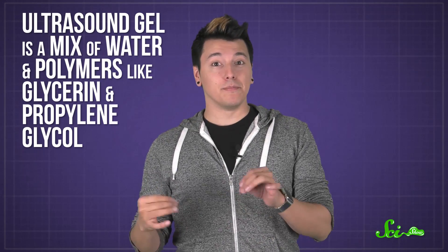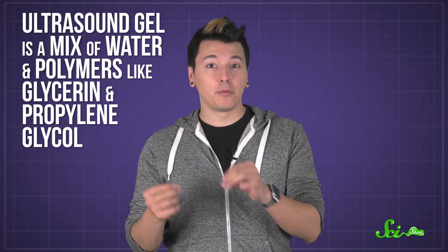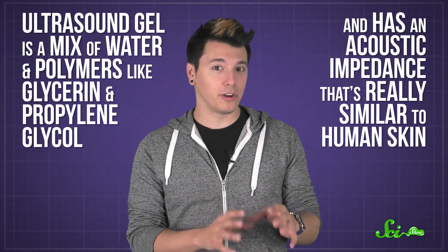Ultrasound gel is a mix of water and polymers like glycerin and propylene glycol, and has an acoustic impedance that's really similar to human skin. By using a transducer to make ultrasound waves in that gel, the waves have a much better chance of transferring into your body, with less reflection right off the bat.